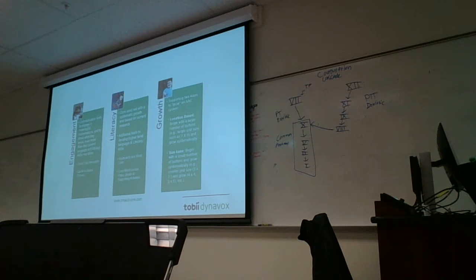And something Professor Doherty had talked about is when would you use certain communication software or different page sets, when would you use each one? So you have to look at the communication or the end user and what their needs are. If they're emergent communicators, if someone that's literate or someone that's a little bit older, a lot of our older clients will use text-based communication page sets. So it depends on what their need is, what level they're at, and you're able then to build off of there.